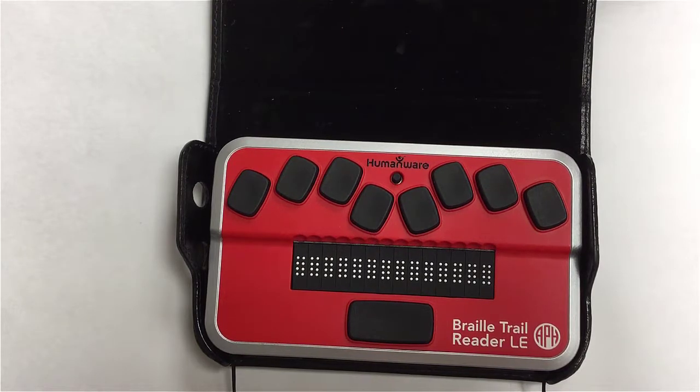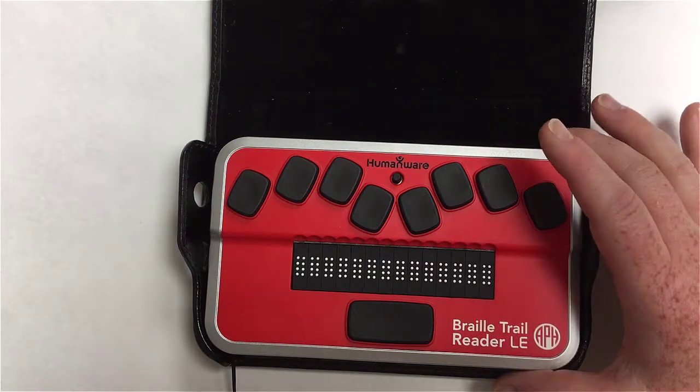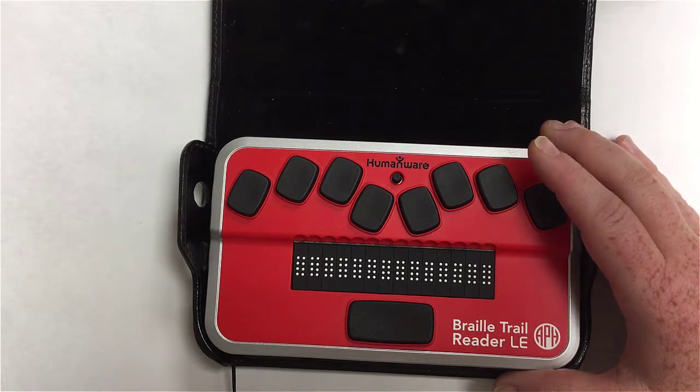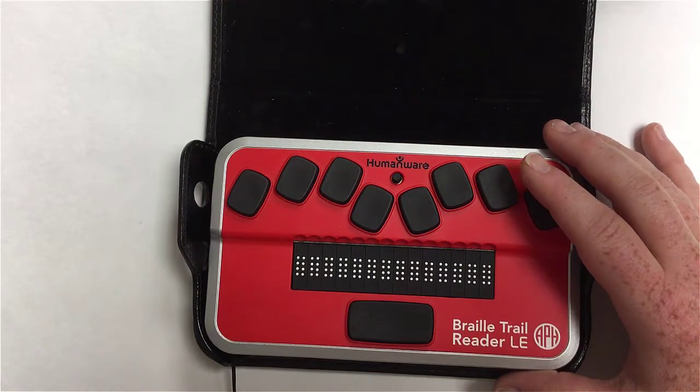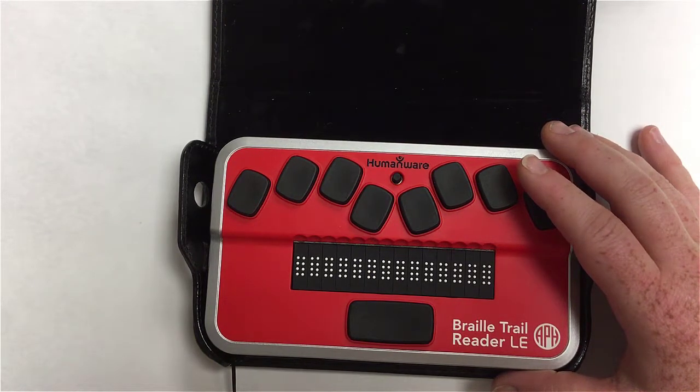Hello and welcome to our second installment of the Braille Trail Reader from APH. In this tutorial, we're going to go through the menus and the settings. In the previous one, we looked at orientation to the unit. I put the case back on this time because we don't need to be turning the unit to show various things, so if you can see the screen at all, you might notice it looks a little different.